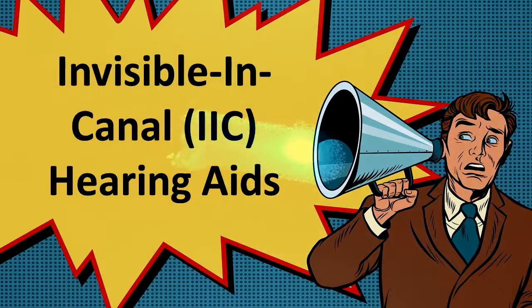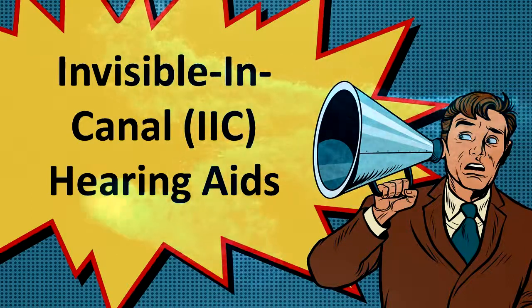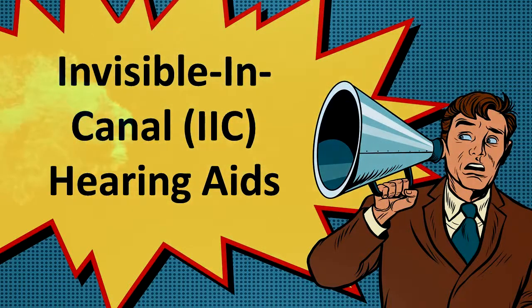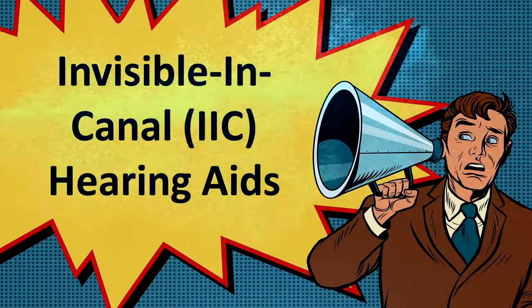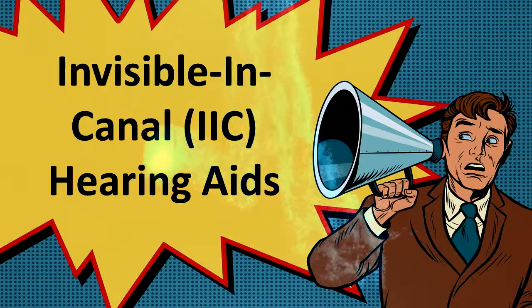Another type of hearing device that is considered invisible is the behind-the-ear unit. These models are also fitted to your ear based on the shape of your ear and the level of your hearing loss. These units are typically recommended to people with mild to moderate hearing loss. The BTE, behind the ear, models are only actually visible if a person sees the tube that enters the ear from underneath. The hearing models that fit into the canal itself are a little more invisible. These types of hearing units are used by people who suffer from moderate to severe hearing loss.